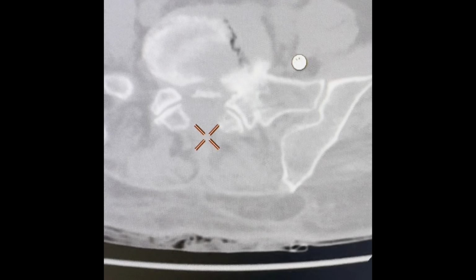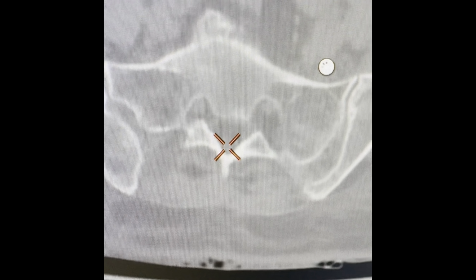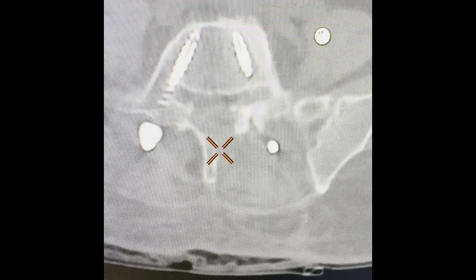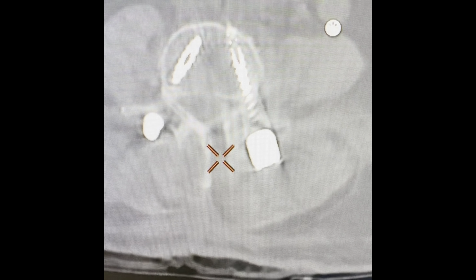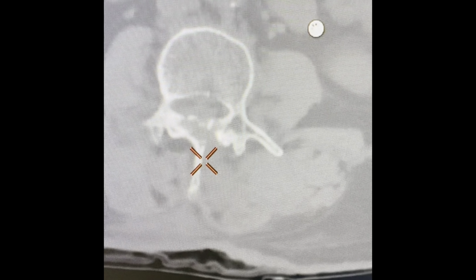So you can see how unilateral laminectomy has been done for this patient. From here to here, all laminectomy has been done by biportal endoscopy. You see, decompression has been done in multiple levels, completely by biportal endoscopy.